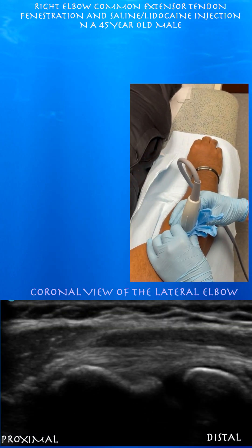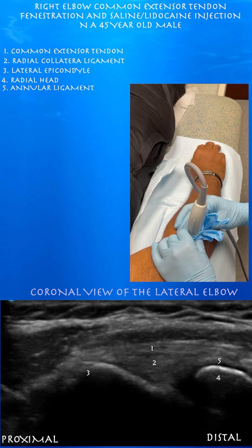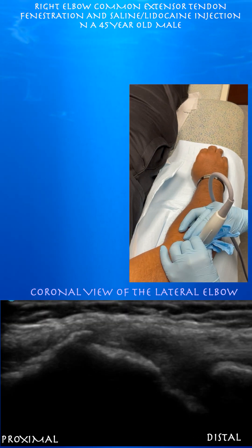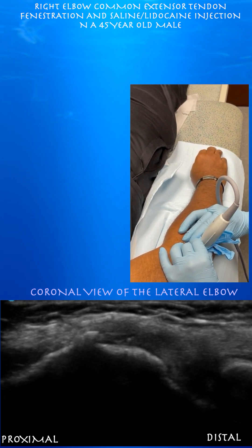Right side is distal. You can see the lateral epicondyle and the common extensor tendon insertion. The radial aspect of the common extensor tendon looks fairly normal in this view. On the ulnar aspect, you can see some calcification and some thickening of the common extensor tendon.